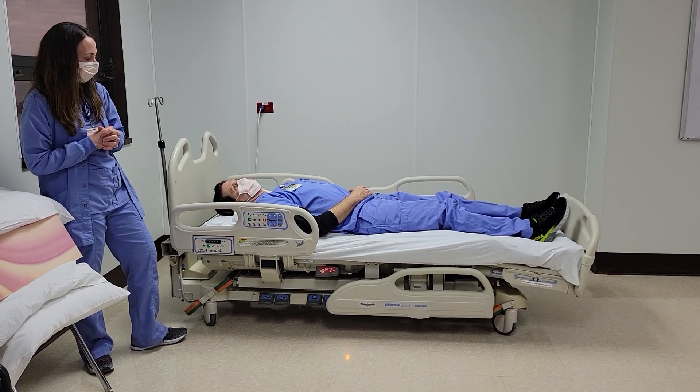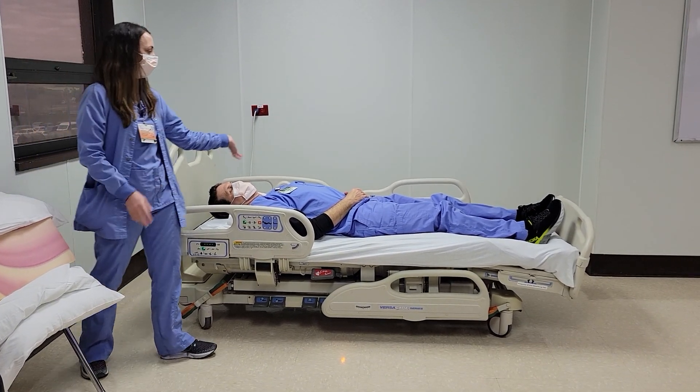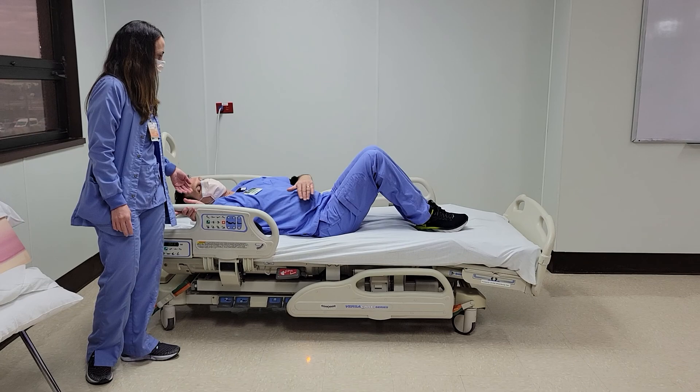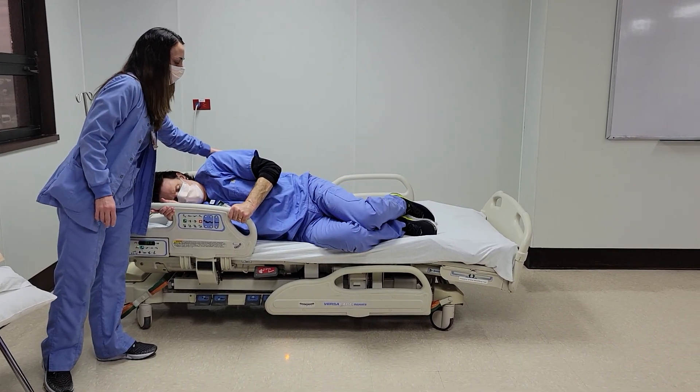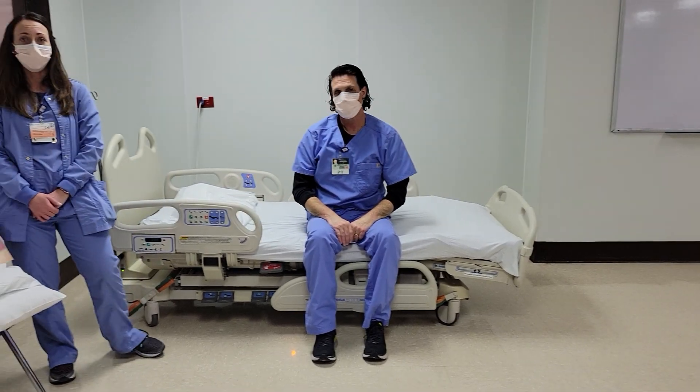That pretty much concludes all the bed positioning. Steve's going to get out of bed — he's going to roll, grab the rail, drop his feet, and push up. Thank you for your time.